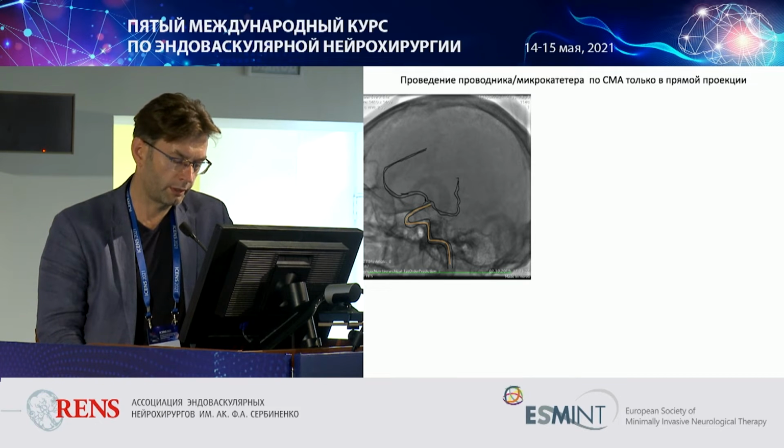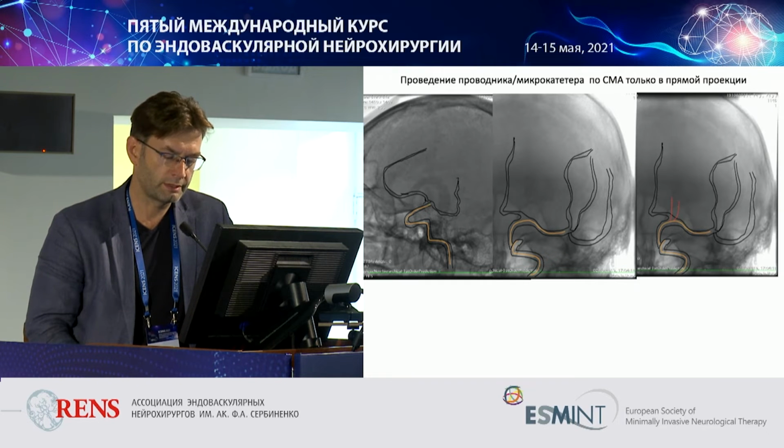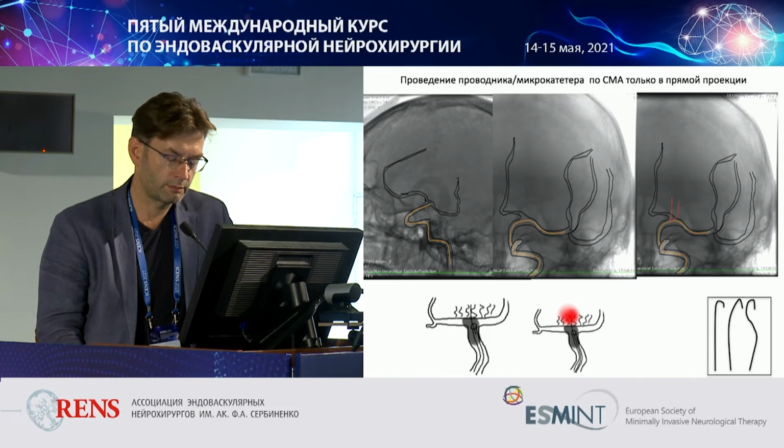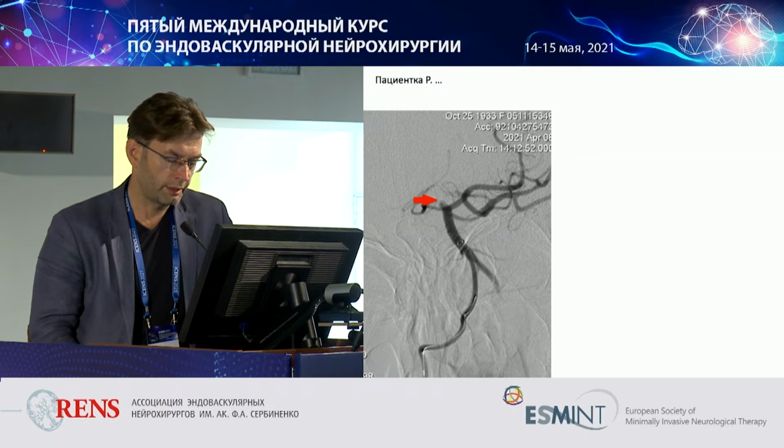And after you've put your instrumentation over the supraclinoid segment, you can clearly understand whether your tool goes in the cerebral artery, because it starts to go vertically. It might mean your microcatheter has entered small vessels, which may result in the formation of a hematoma.